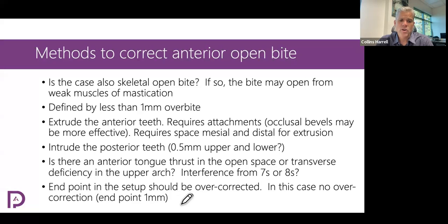Okay. The endpoints, the target points of our setup should be overcorrected. In this case, there was no overcorrection done, we'll see. And the case worked out really well. And we'll talk about that a little bit as we look at it. But just be aware of some of these points as we go into looking at this case.